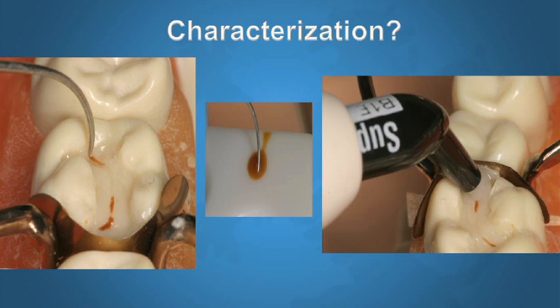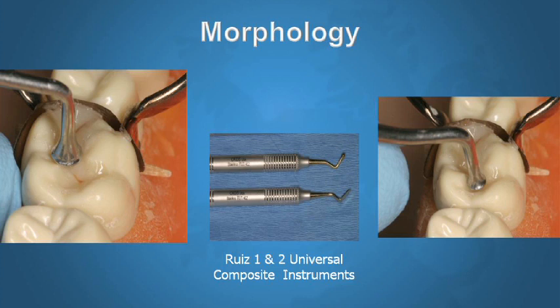You may choose to apply stain. That's just something that makes me happy, but most of the time I try to avoid it, because some patients don't like the little stain, although we think it looks way more normal and more natural. And then the final increment is going to be with a regular composite, and we're going to give it the morphology with our instrument before curing.